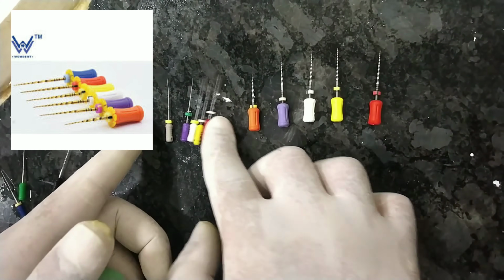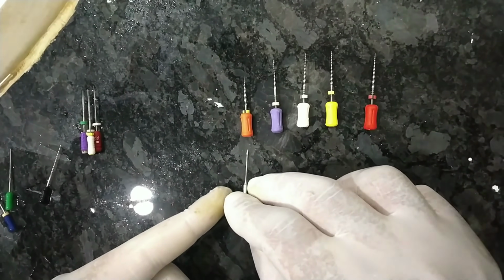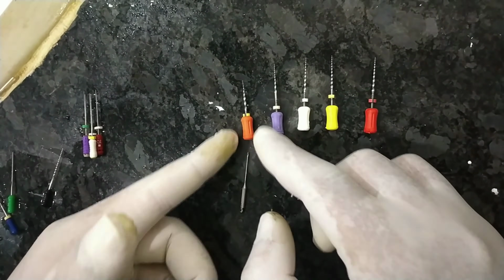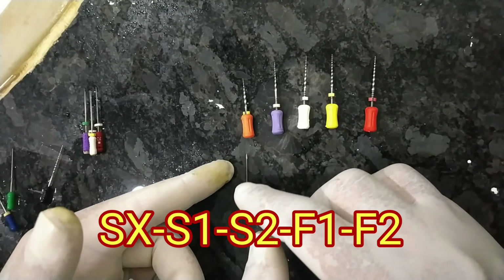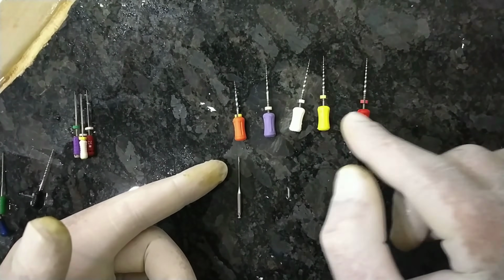Now we'll come back to the Protaper files. What is the sequence? The first is the coronal flaring file or the SX files. Instead of it, we can also use the Gates Glidden drill. So this one you can use in only 5 to 6 canals. This one you can use in many canals, around 15 to 20, but you make sure you autoclave them. Then is the S1, shaping 1, shaping 2, F1 and F2.